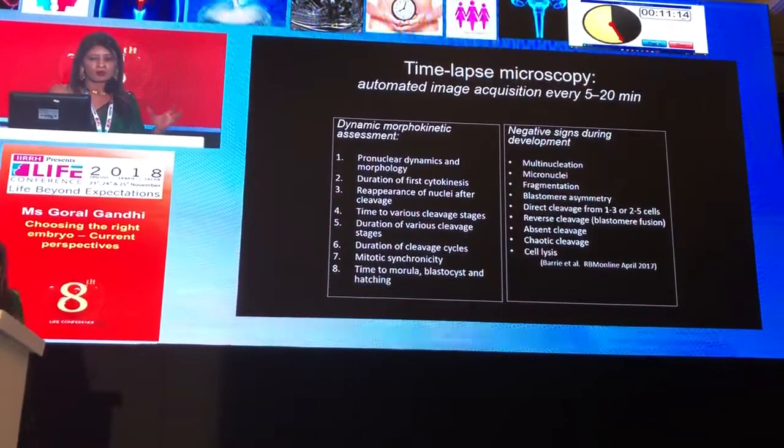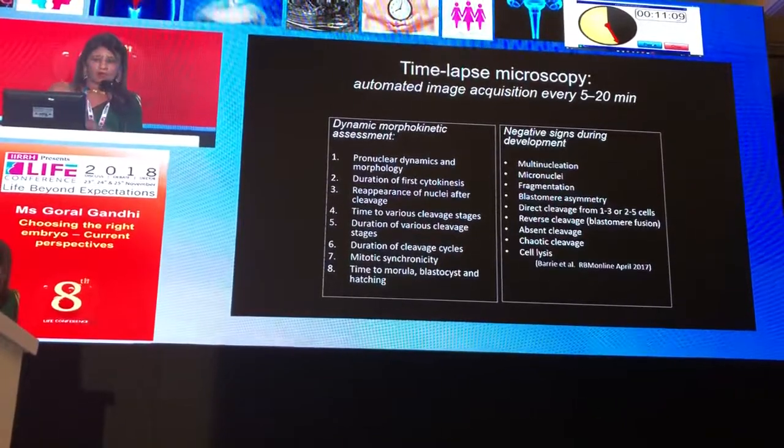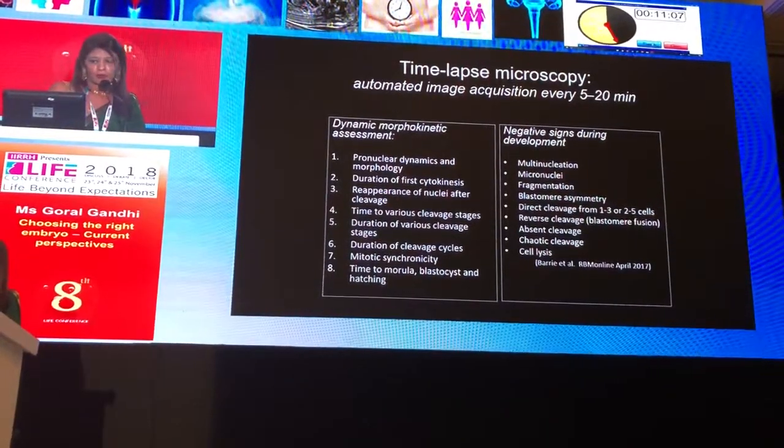So these are the embryos that we are going to deselect. These are the embryos that we do not want. These are the embryos that may not be chromosomally normal.